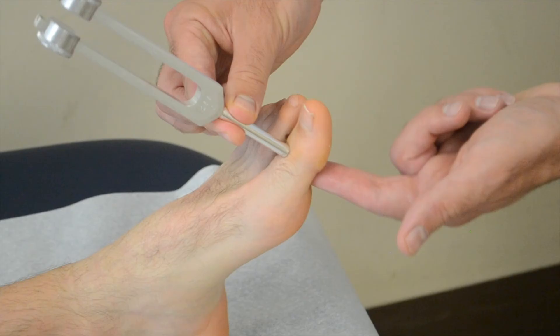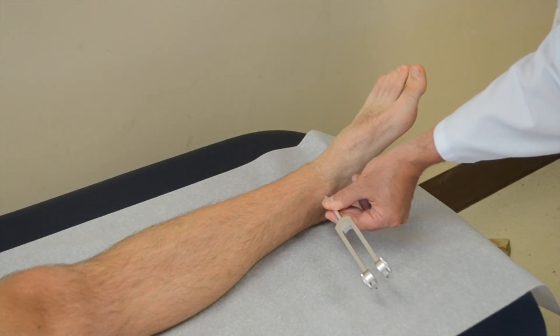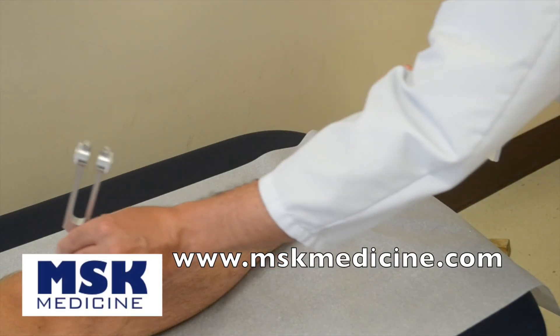If you can still feel vibration but the patient cannot, move the tuning fork over their malleoli, their distal shin, or their knee and determine whether or not they can still feel it in these regions.